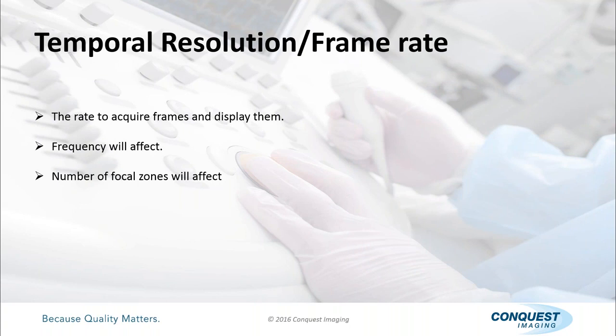Moving on to temporal resolution or frame rate. Basically, frame rate is the rate that it takes to build an image on the ultrasound monitor. And there are different things that can affect it. Frequency will definitely affect it, so the frequency of the probe. Also, the number of focal zones can affect how quickly it's acquired or displayed.